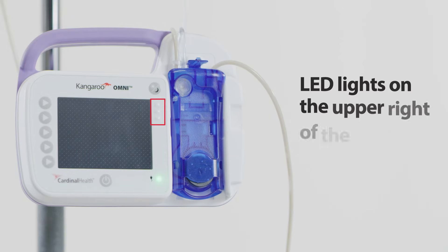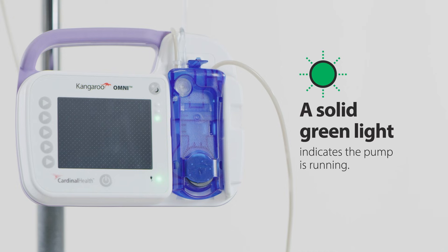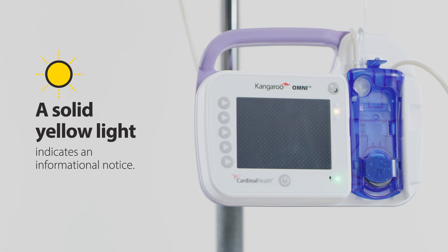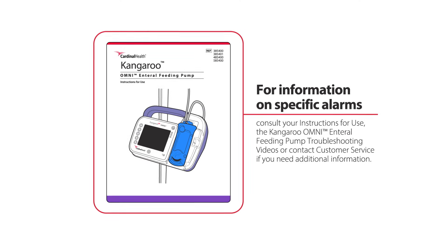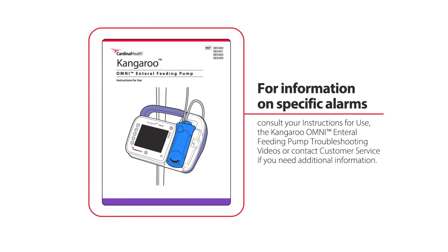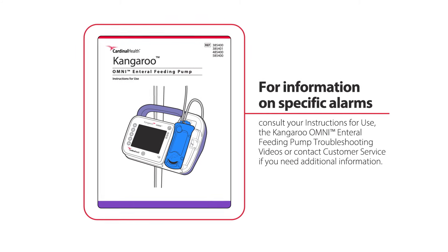LED lights on the upper right of the pump indicate the pump's status. A solid green light indicates the pump is running. A blinking green light indicates the pump is ready for operation but not feeding. A solid yellow light indicates an informational notice. A blinking yellow light indicates a caution. A blinking red light indicates a critical warning. For information on specific alarms, consult your Kangaroo Omni enteral feeding pump instructions for use, the troubleshooting videos, or contact customer service.